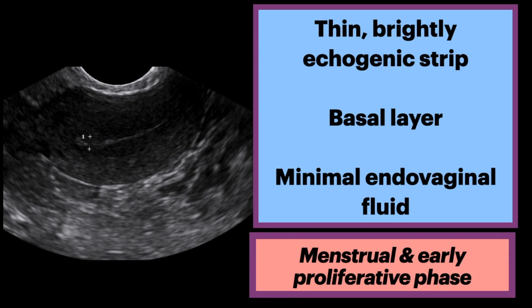Let's see how the endometrial stripe changes with the menstrual phase. In the menstrual and early proliferative phase, it is a thin, brightly echogenic stripe comprising the basal layer. Minimal fluid can be seen endovaginally within the endometrium in the menstrual phase.